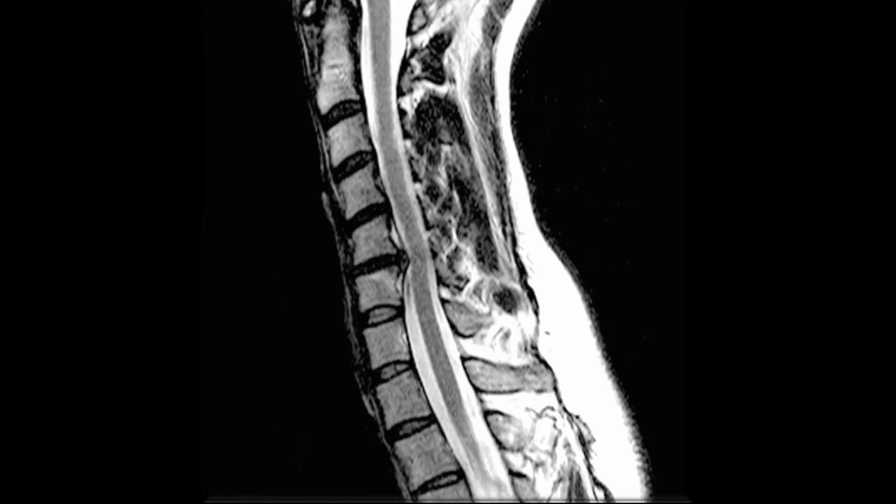This is an MRI, and again, the increased pressure here will cause the disc to bulge out in the opposite direction, just like the jelly would in a donut. In this case, the disc is hitting into this structure here, which is the spinal cord.